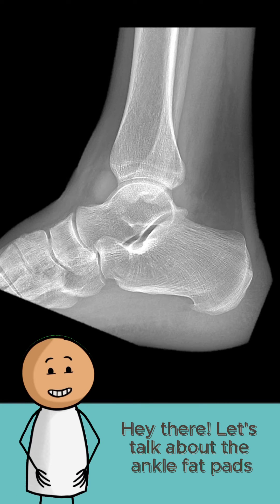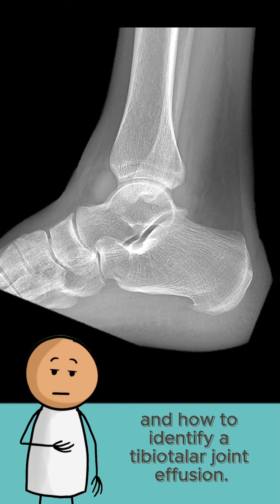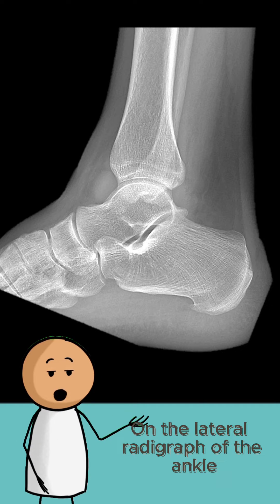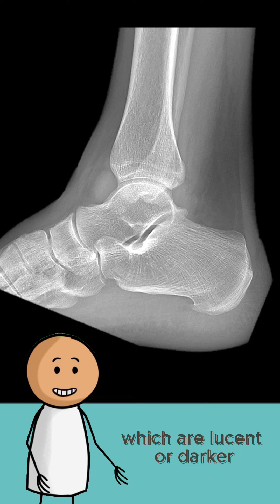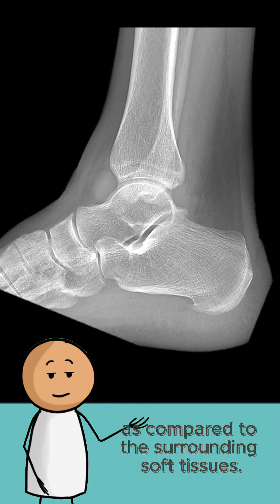Hey there! Let's talk about the ankle fat pads and how to identify a tibiotalar joint effusion. On the lateral radiograph of the ankle, we can identify three fat pads, which appear lucent or darker as compared to the surrounding soft tissues.